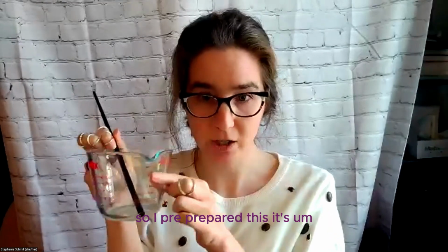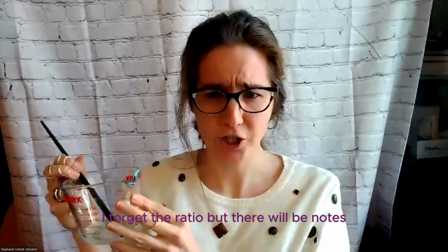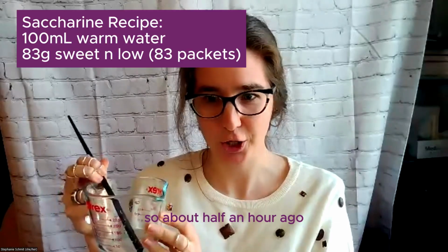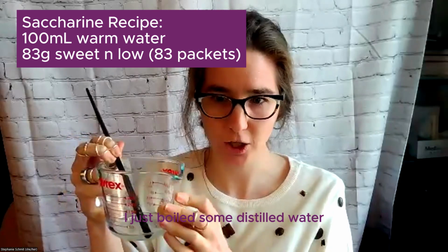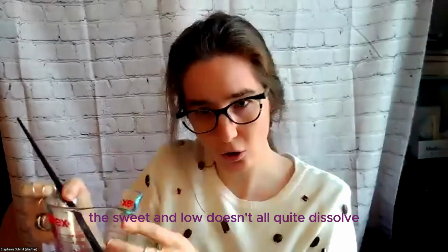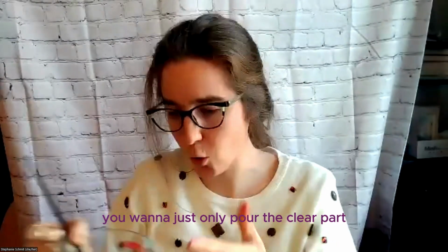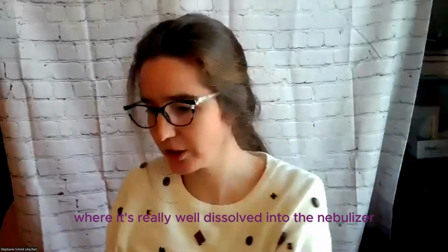So I pre-prepared this. I forget the ratio, but there will be notes. It's warm distilled water and Sweet'N Low packets. So about half an hour ago, I just boiled some distilled water and put in a bunch of Sweet'N Low packets. The Sweet'N Low doesn't all quite dissolve. I don't know if you're going to be able to see this, but you want to only pour the clear part where it's really well dissolved into the nebulizer.